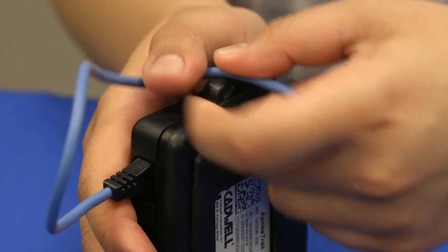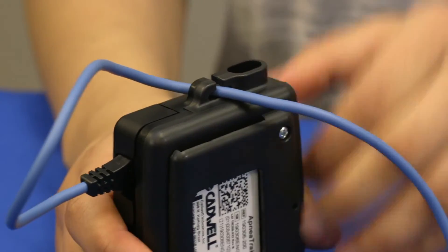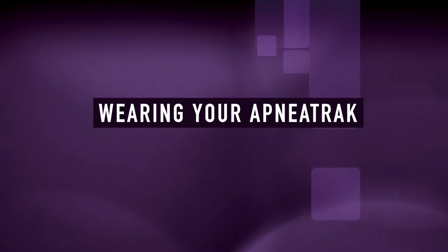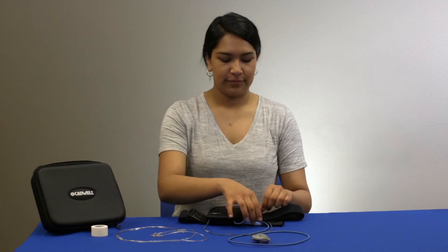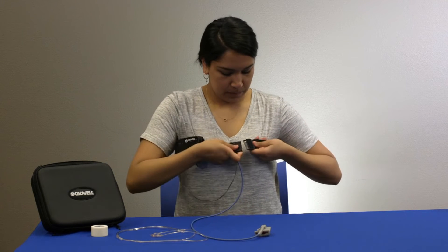Press the oximeter cable through the hook on the side of the apnea track. Place the chest belt around your chest and fasten the buckle.